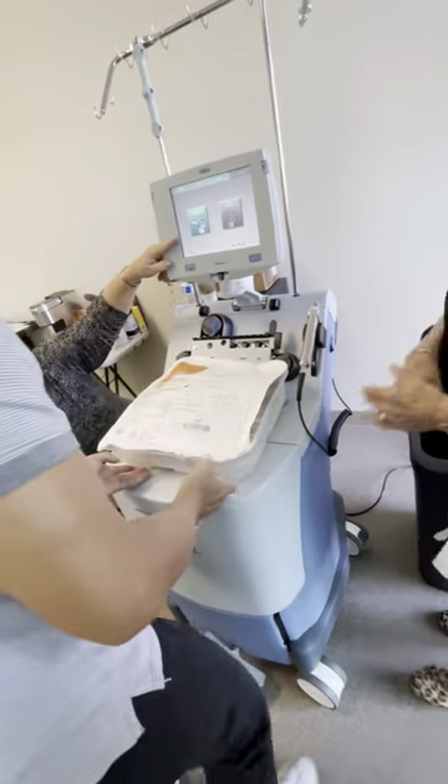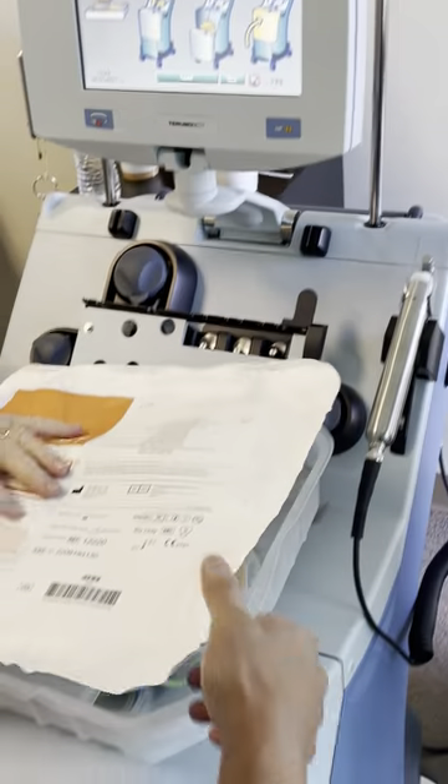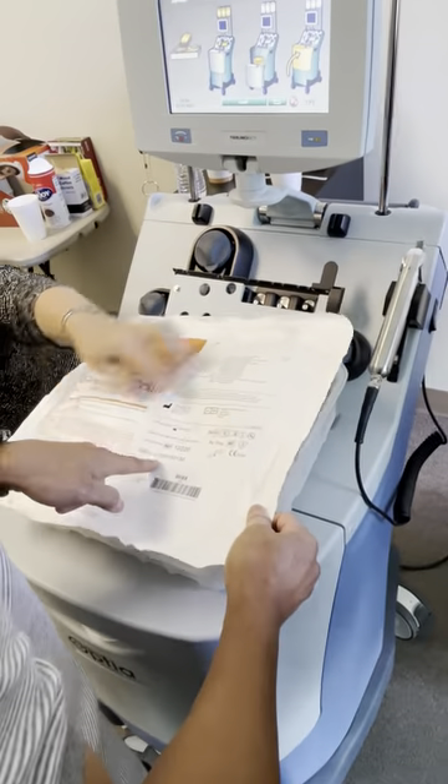Now press prepare tubing set, ignore the steps. Open the box after looking at expiration. Very good.